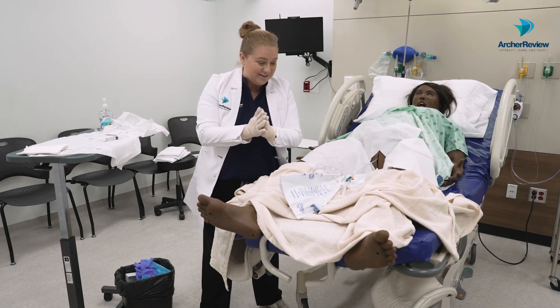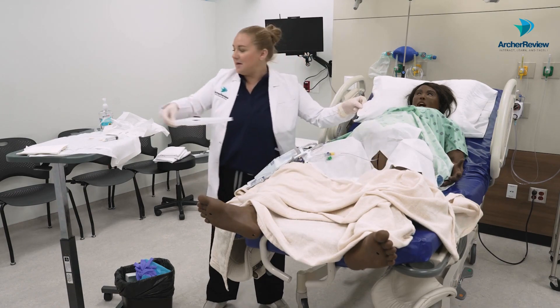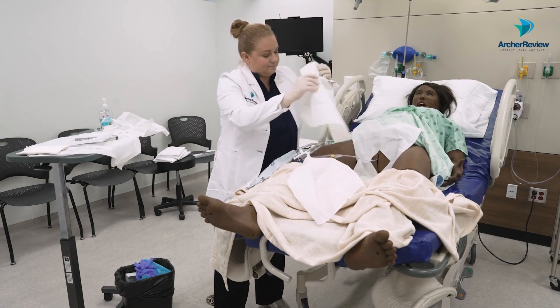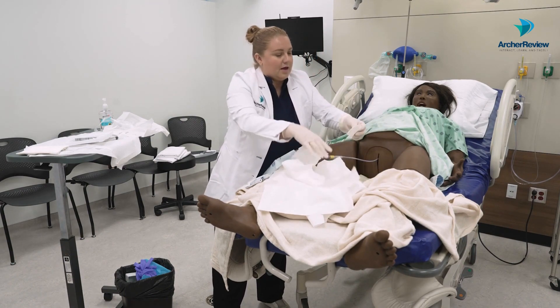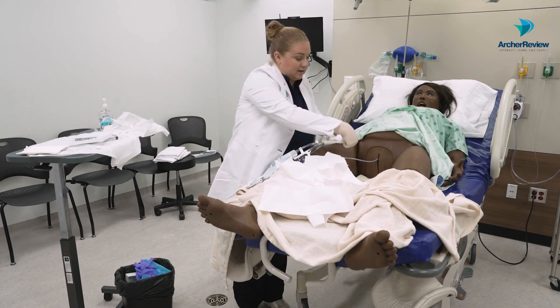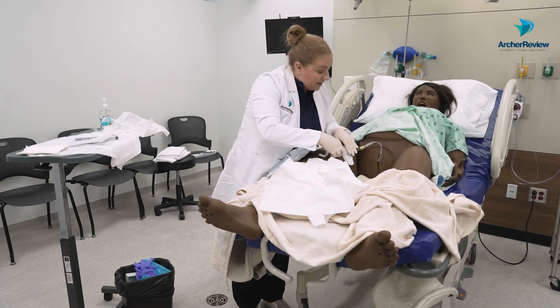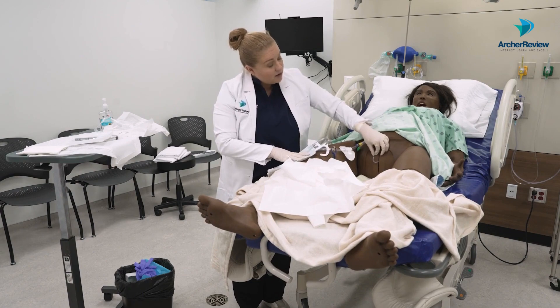Now we're done with the sterile part — you can loosen up and touch what you need to touch. We've got our bag. I'm going to grab my last important piece of equipment: the catheter securing device. These go on kind of like a little Tegaderm. We're going to move our sterile drapes now that we're done being sterile, and we're going to get this secured to the thigh. It's just like a little sticker, a little dressing like that, and then we put the catheter tubing right down here in the middle, it snakes through, and the Velcro is on. The catheter is nice and secure — it's not going anywhere.